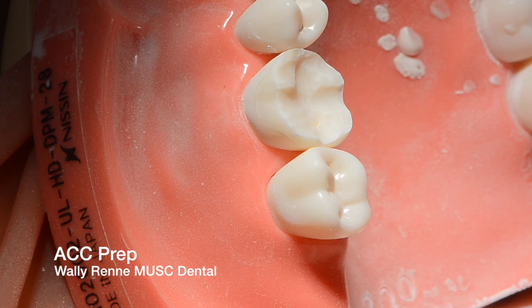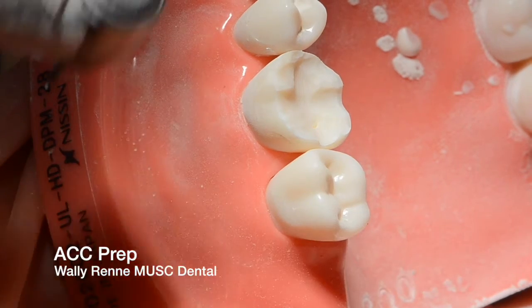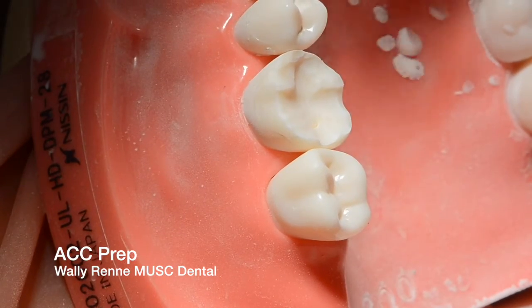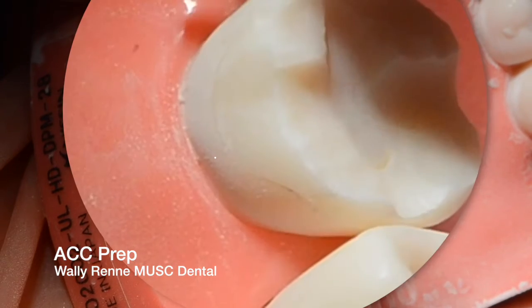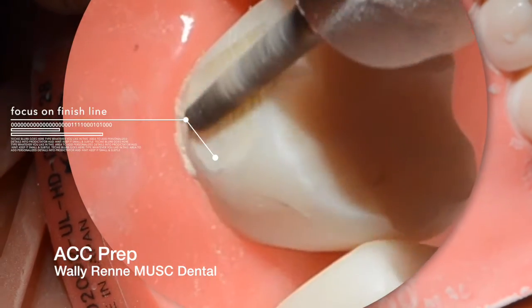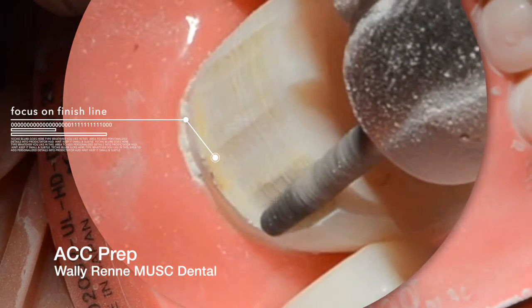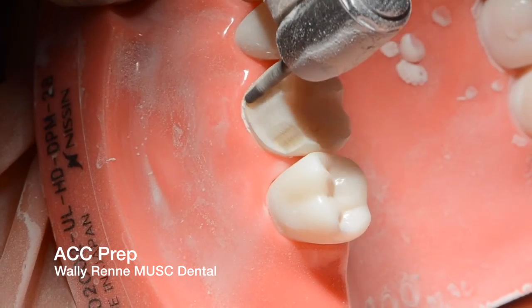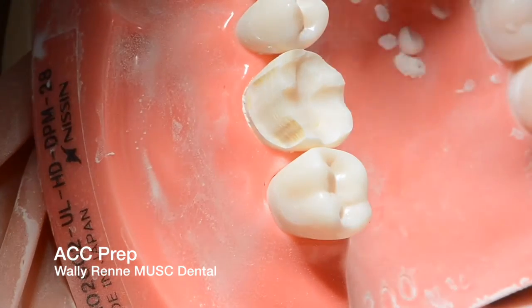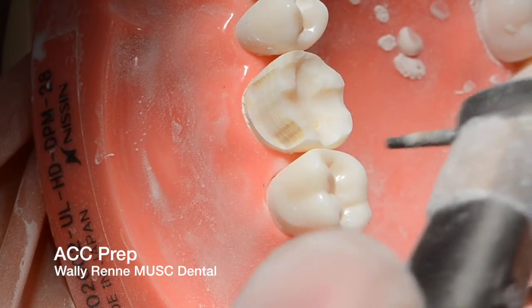It's a rounded shoulder — the 878K016 diamond. The tip is roughly around 0.8 millimeters. For your axial reduction, just focus on your finish line. Holding the bur parallel to the long axis of the tooth, let the shoulder be created automatically by the diamond. Don't be concerned about how much axial reduction you're getting because it's dictated by your shoulder width and your taper.